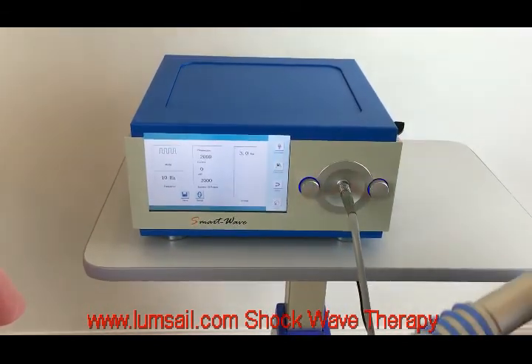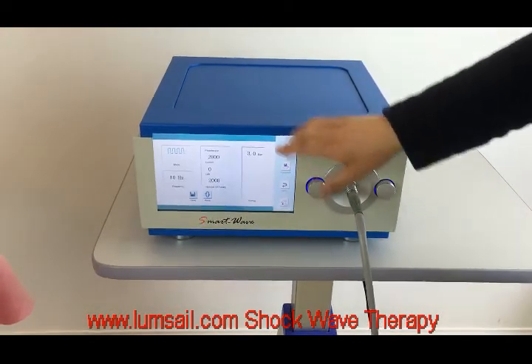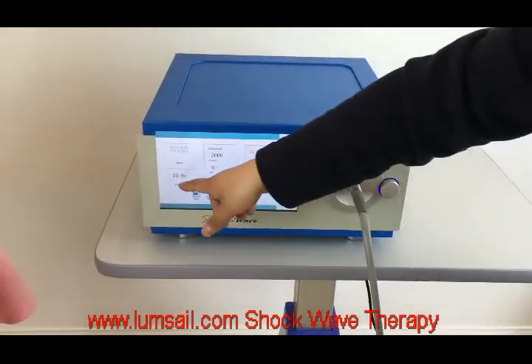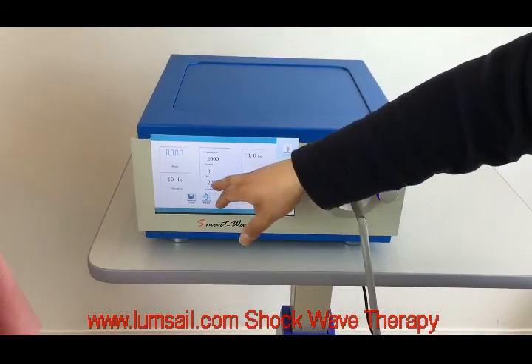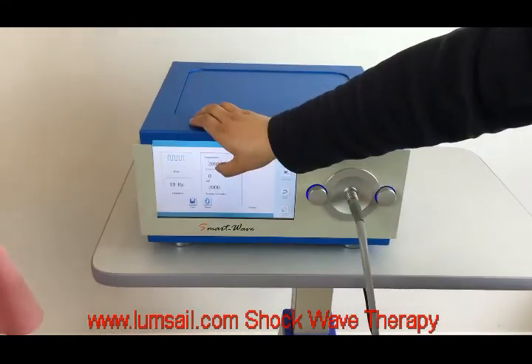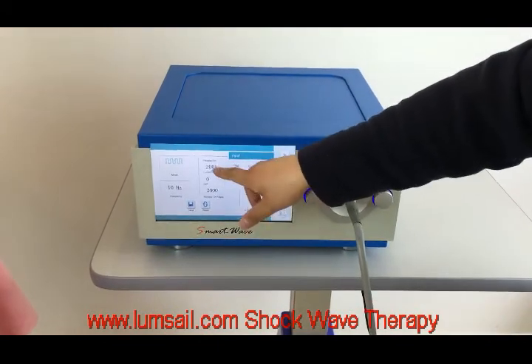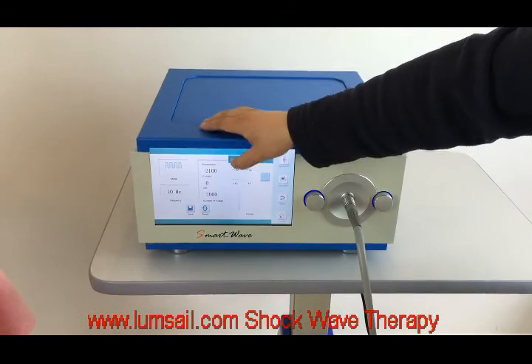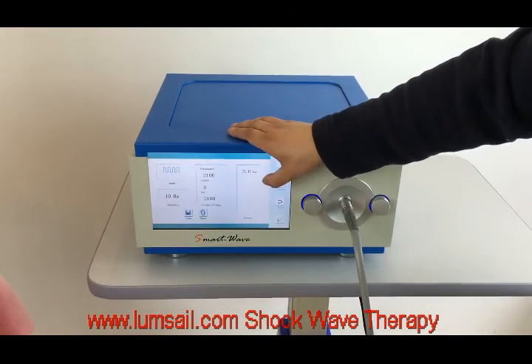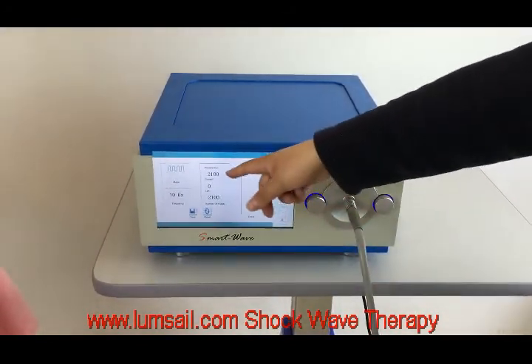We enter the treatment menu. The default settings are energy at 3 bar and frequency at 10 hertz. By default we recommend 2000 shots for one treatment. You can also click this button to call out the calculator and increase or decrease as you like. We confirm 2200.